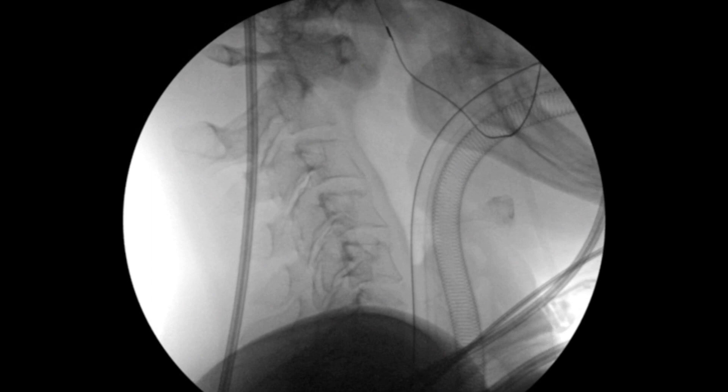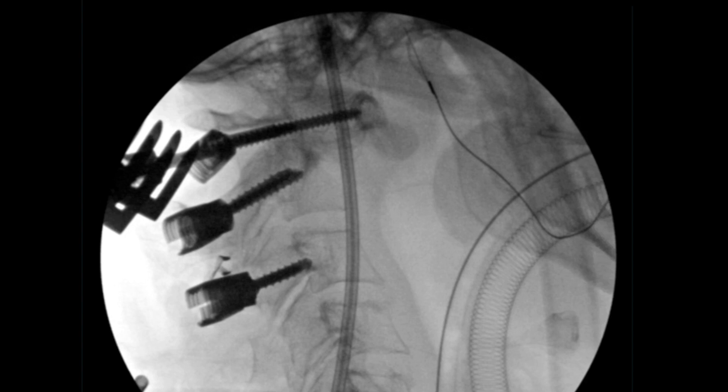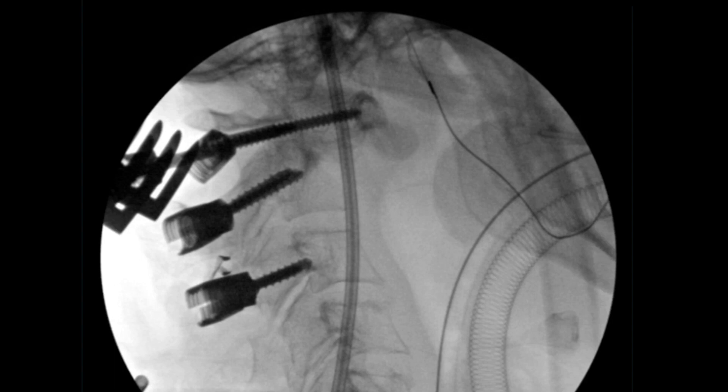Decompression via C1 laminectomy and instrumentation was then performed. C1 lateral mass screws were placed with 5 degrees of medial trajectory and bicortical purchase. At C2, bilateral pedicle screws were placed, and at C3, lateral mass screws were placed due to poor bone quality.